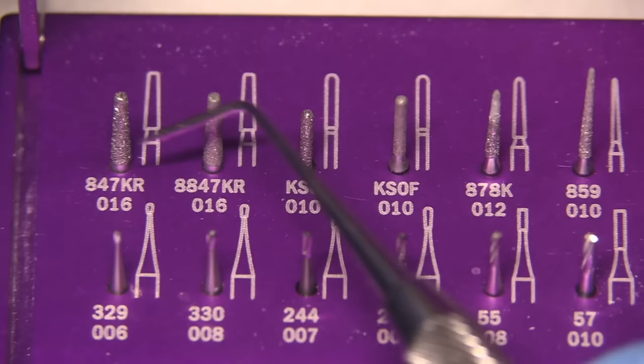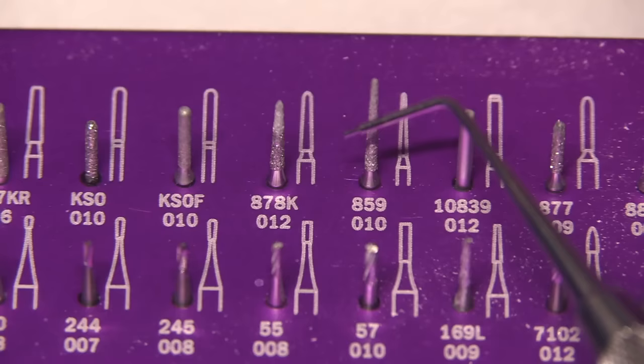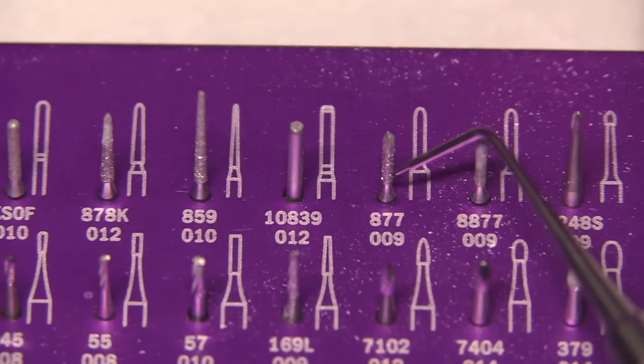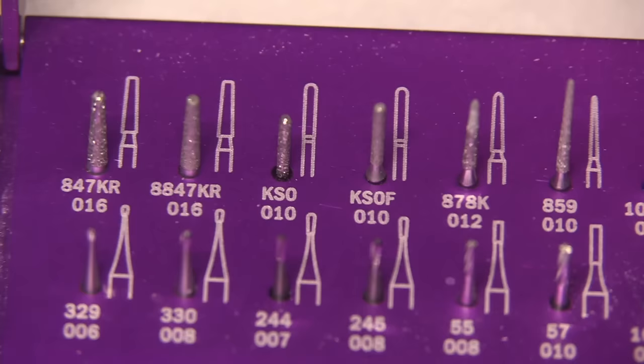The burrs we're going to use today are the 847KR016, which measures 1.6 millimeters at its widest point, and the finishing version of that, which is a 30 micron grit diamond. The 878K for our axial walls, the 859010 for the interproximal so we can use the end cutting, and then these little chamfer type burrs for most of the lingual chamfer and some of the interproximal. We're going to start the preparation off today with occlusal reduction using the 847KR016.